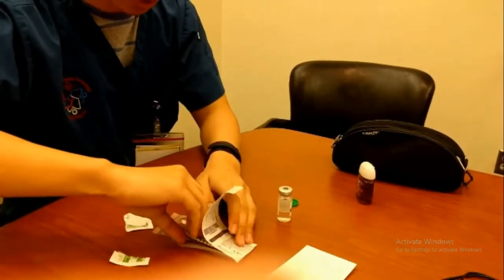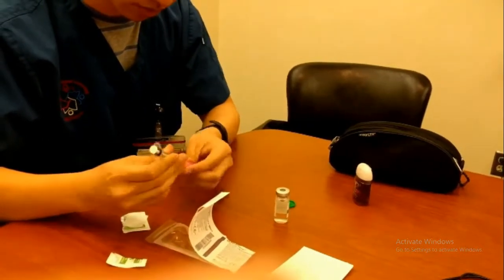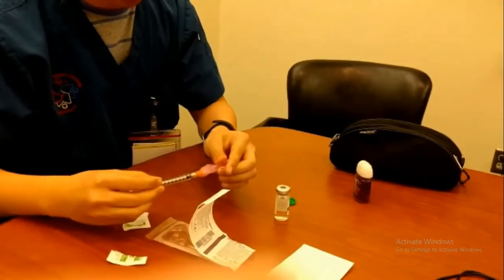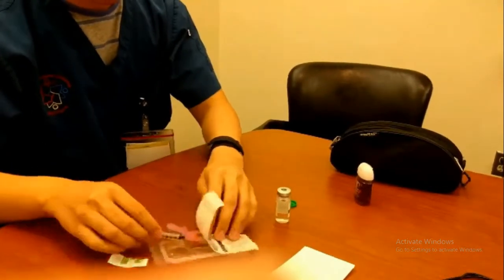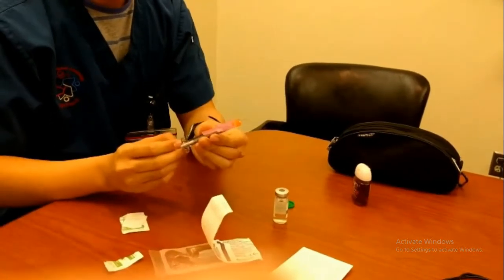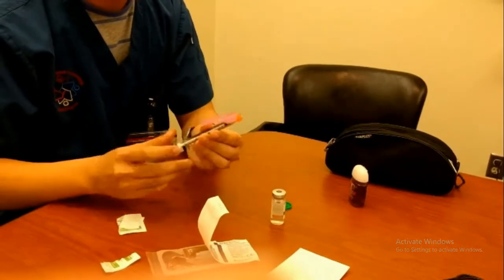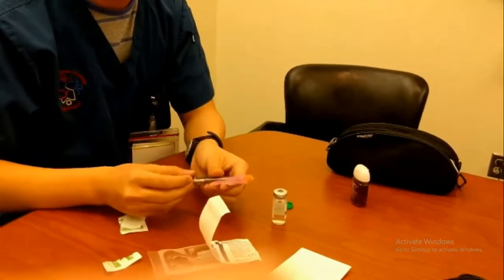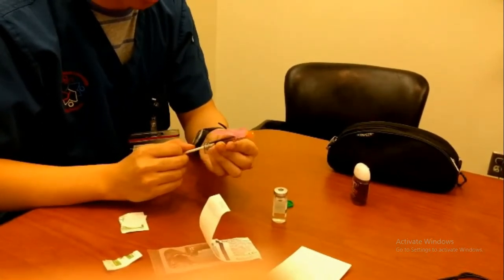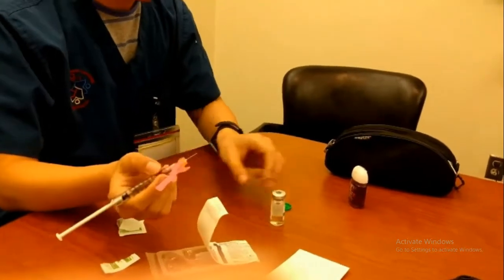And I would be taking the syringe, and taking the needle, screwing on the needle. Then I will be taking back the shield lock, taking off the cap. I'm going to aspirate air into the syringe to ensure that it works properly, as it does. Since I'll be doing the heparin injection, I'll be doing 1 ml. So I'm going to aspirate air up until 1 ml. There we go.